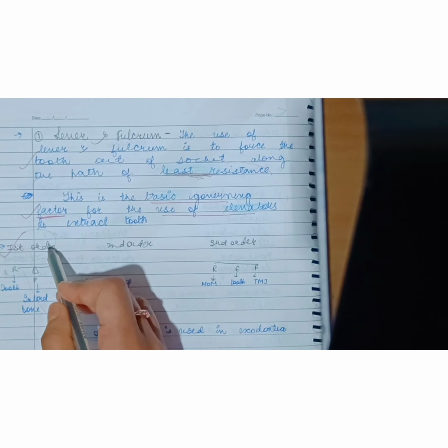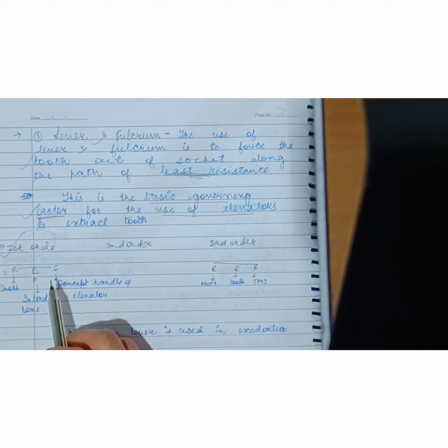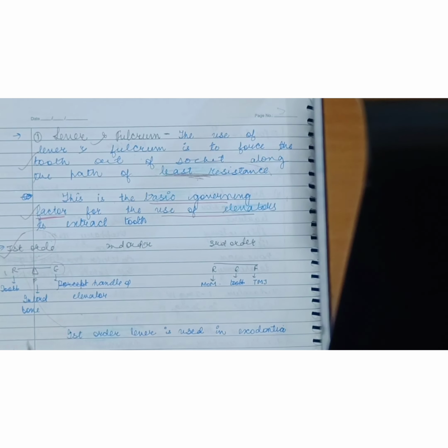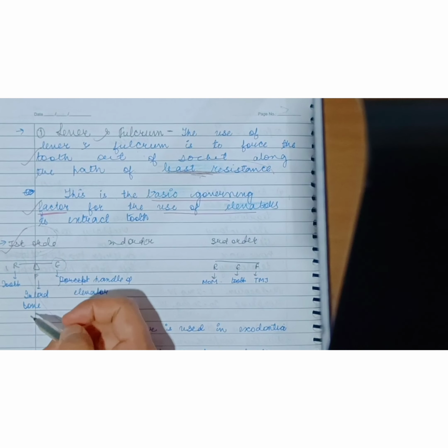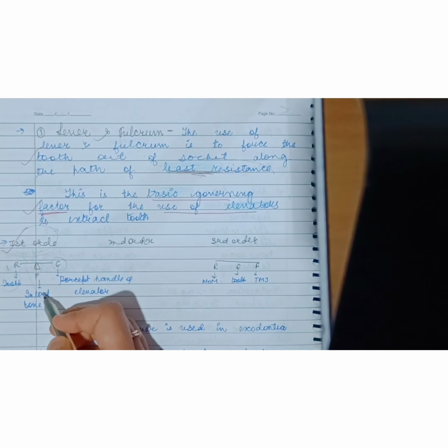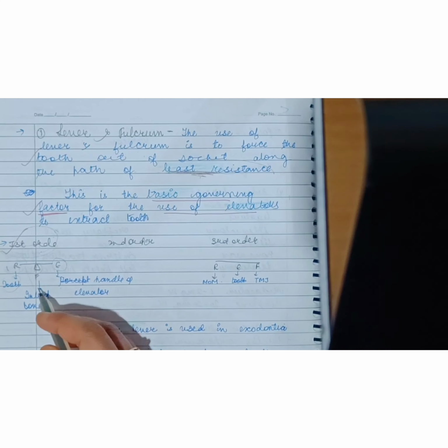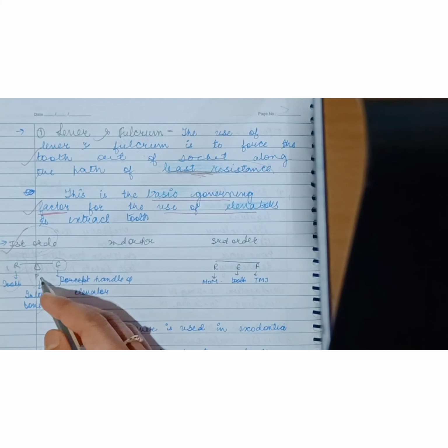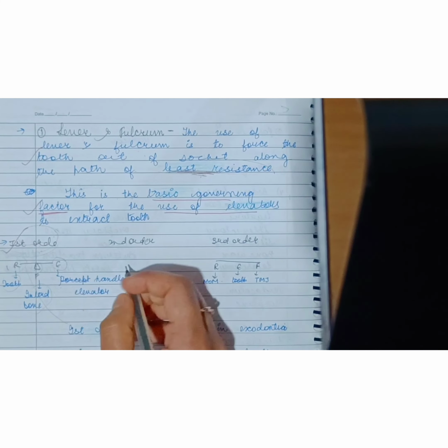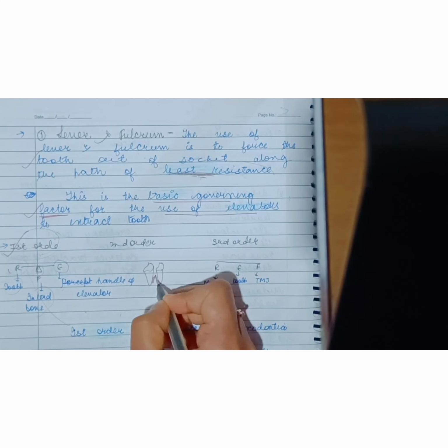The first order lever is used in Exodontia and it has the most mechanical advantage. In the first order lever, the fulcrum is present in between the resistance and the effort arm. So in Exodontia, resistance is the tooth, fulcrum is the interradicular bone, and effort is the handle of the elevator. So remember that interradicular bone should be made the fulcrum and not the adjacent tooth. Why? Because if we use, see, this is the interradicular bone.